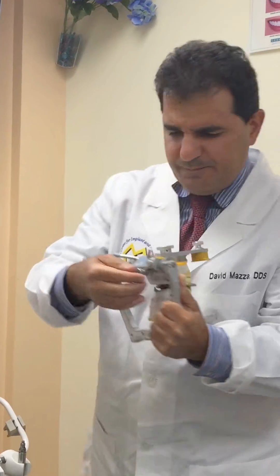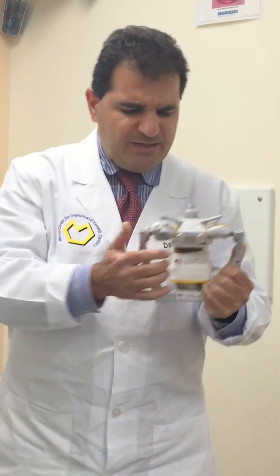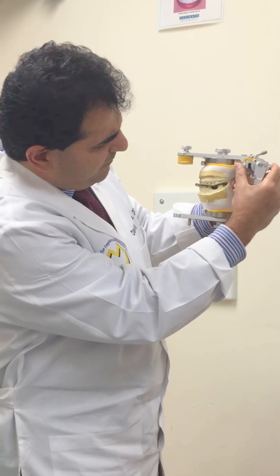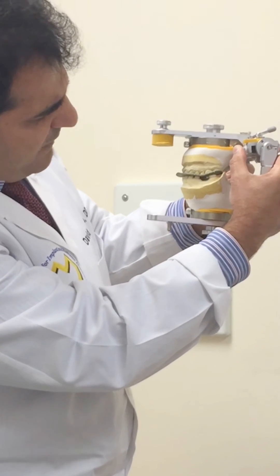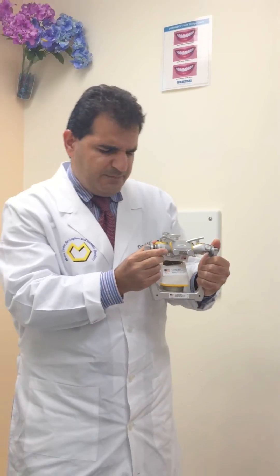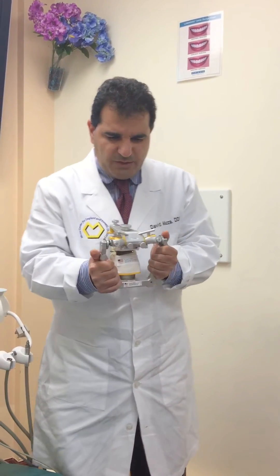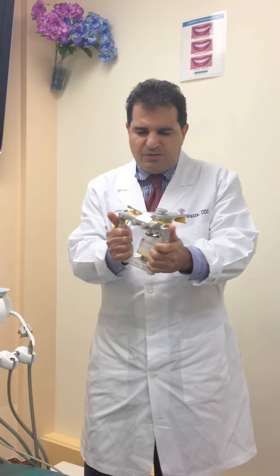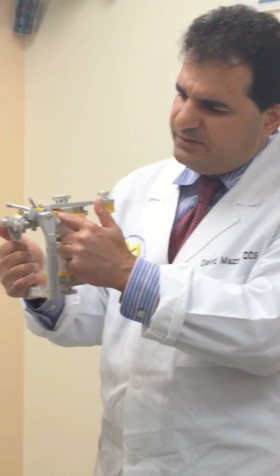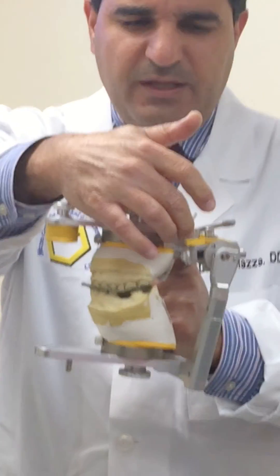When it's done I will stop and fasten the condylar housing thumb screw on that side. The same thing on this side — I go up and down until I have the best adaptation of my maxillary cast wax and mandibular cast, then I fasten and tighten my condylar housing thumb screws. At this point I have a condylar inclination guidance scale reading at the right side and also at the left side that are now determined.